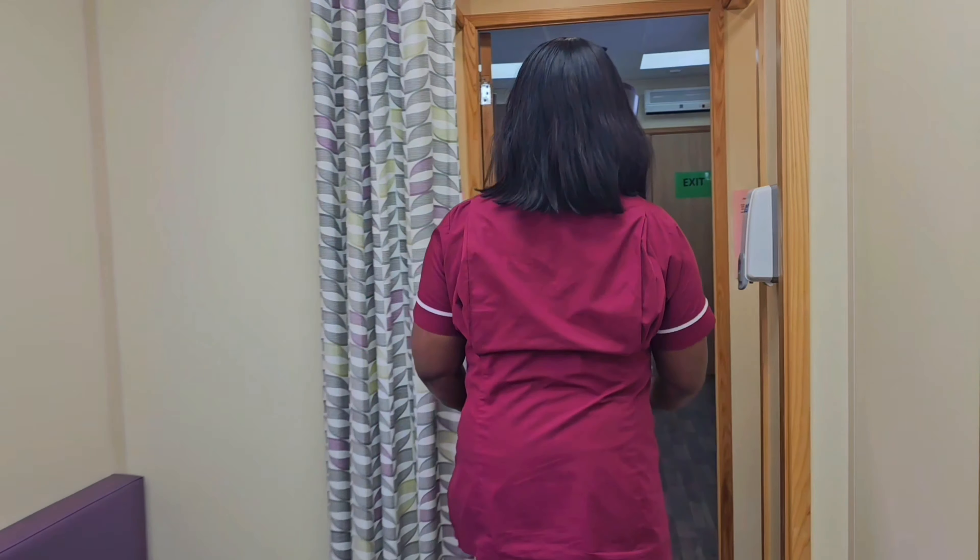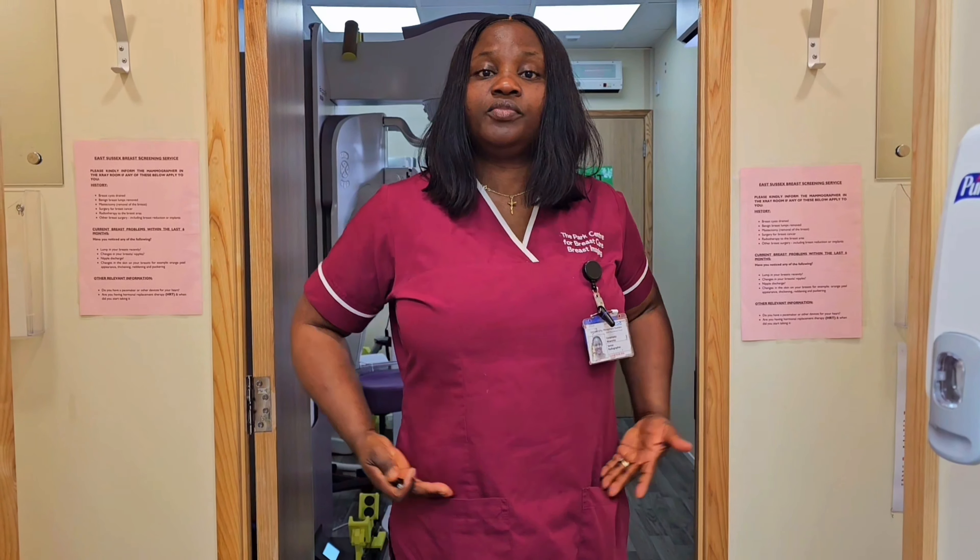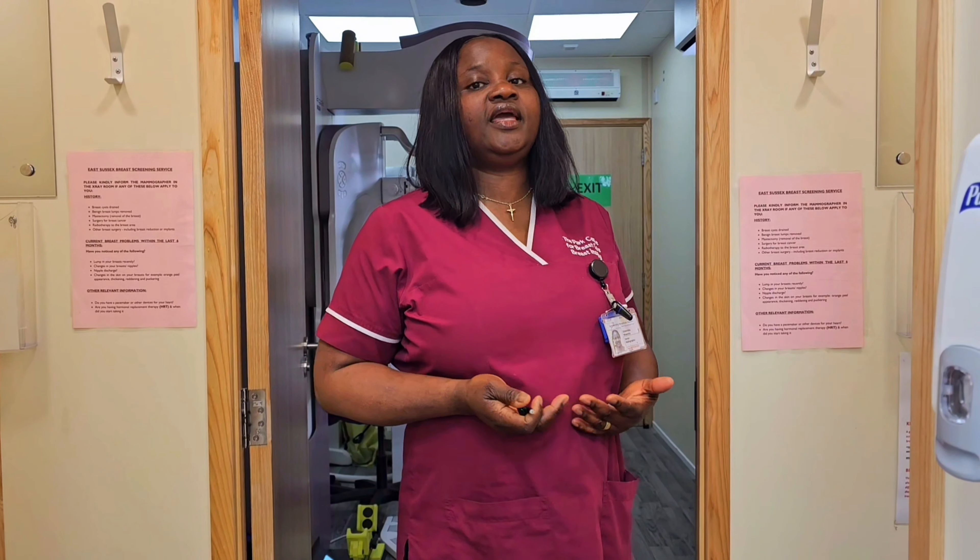After you've been checked in, you will be asked to come into one of these cubicles to change. Usually, you take everything off from the waist up and then put back a layer of your own top. This is to keep yourself covered while you wait to be called in for the mammogram.